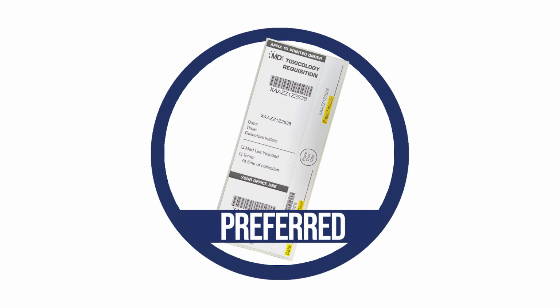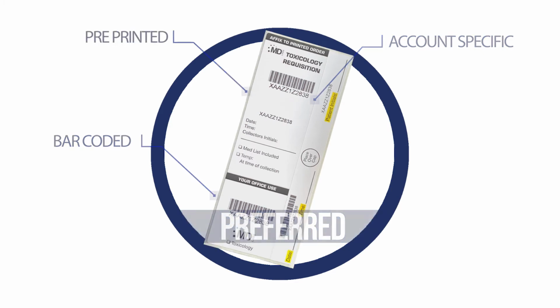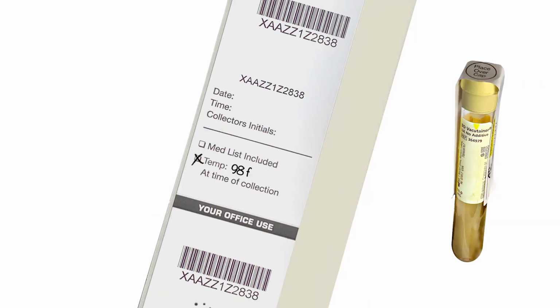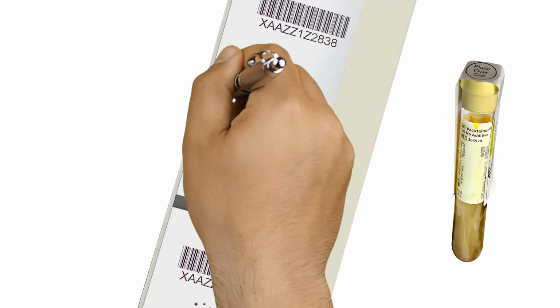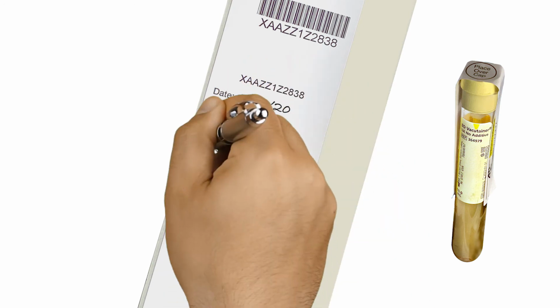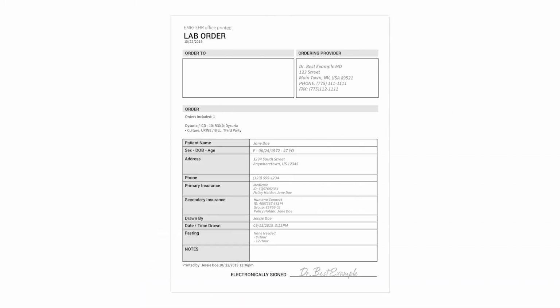The preferred and easiest method is using the pre-printed account-specific, bar-coded toxicology requisition stickers. Since you already entered the temperature and affixed the chain of custody label, all you need to do is enter the collection date and time, collector's initials, and check that the medication list is included. Then affix this sticker to the printed lab order that came from the EMR/EHR system.